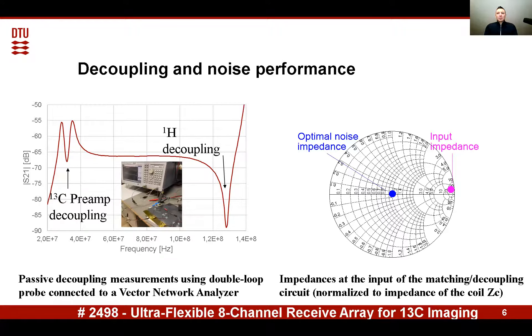The resulting impedance of the pre-amplifier at the terminals of the coil is shown on the Smith chart. As you can see, the pre-amplifier is noise-matched when directly connected to the coil, and at the same time presents high impedance to the input terminals of the loop, realizing pre-amplifier decoupling.